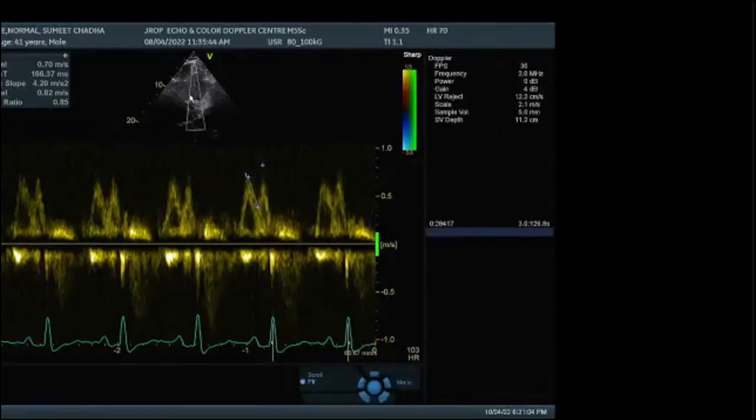Kevin, once we have a 4-chamber view, put a Doppler spectrum pattern across the mitral valve or tricuspid valve. What we look at is initial emptying, which is known as the E wave, and atrial kick, which is known as the A wave. These are only seen in mitral and tricuspid valves. Is that clear, Kevin? What inference do we draw from these waves? The E and A waves tell you about velocity, and will tell you about stenosis of the mitral or tricuspid valve. Second, the E wave and A wave are used for calculation of diastolic flow patterns.